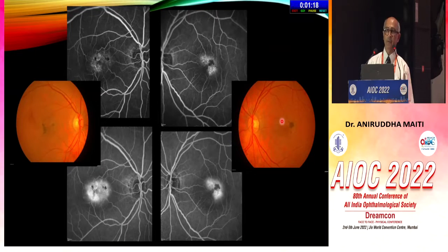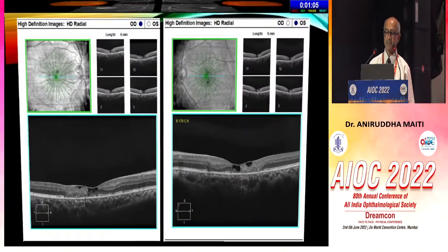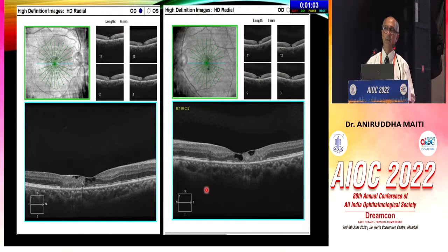And then, of course, we've seen pictures of MacTel where you know the clinical signs on conventional fundus photography, and you are also aware that everything gets completely obscured with fluorescein angiography. So essentially it's just a diagnosis where you're not seeing the disease, but you're identifying it by the fact that there's leakage. Is that timing or?